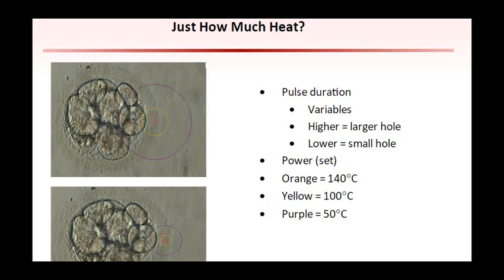These images each show the heat in concentric circles generated by the laser pulse. These are both from the same laser. The upper image represents a laser pulse length of 3,000 microseconds, while the lower panel shows a pulse length of 510 microseconds.